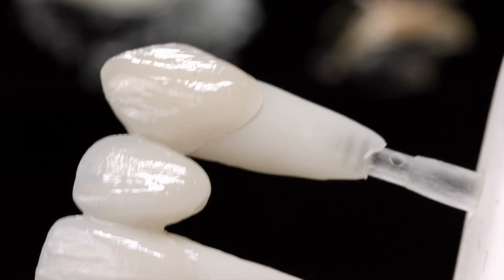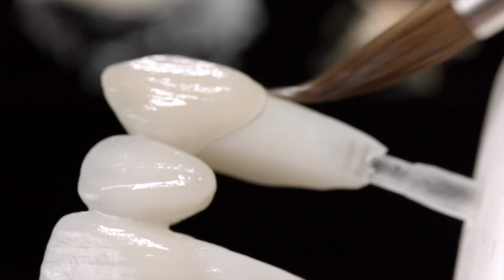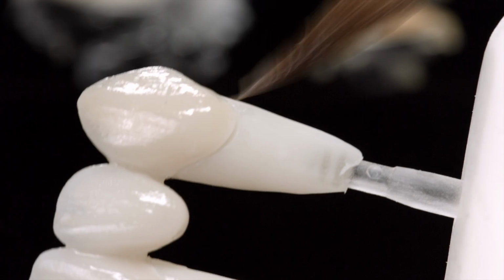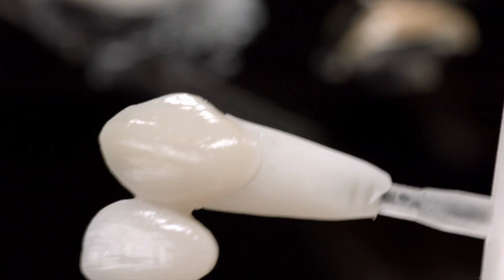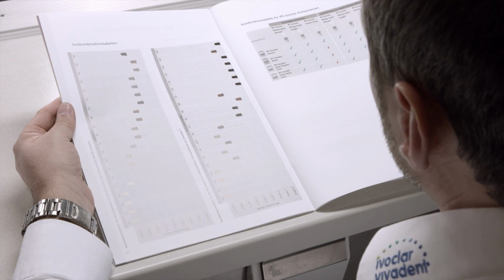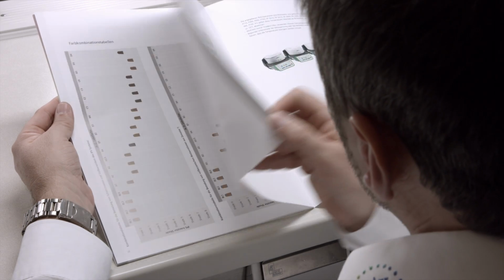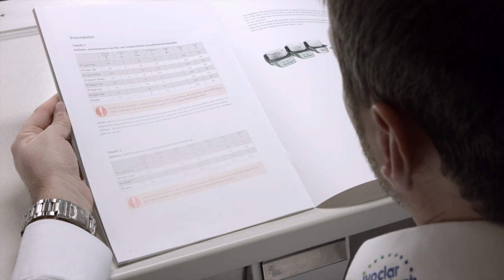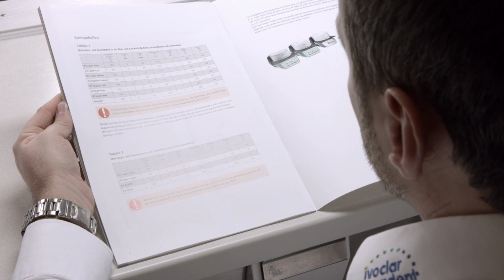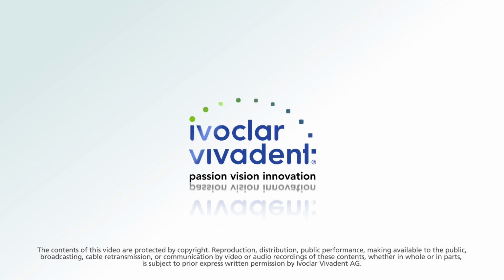The great advantage of IPS Ivocolor is the low firing temperature. This allows you to glaze restorations with monolithic and veneered parts in a single bake. IPS Ivocolor is suitable for all IPS ceramics, with the exception of uncrystallized IPS Emax CAD and IPS Emax CAD-on restorations. During processing, please observe the safety instructions and production details stated in the instructions for use.